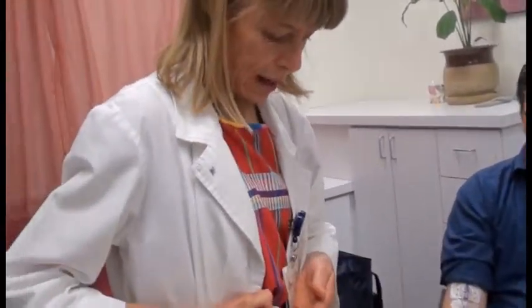All right, so when drawing multiple labs, there's another device. It's called the BD Needleless Luer Lock Access Device for multiple lab draws. So when we're drawing labs using, say, for TPN or a drug lab level where we need to draw multiple tubes, sometimes it's quicker and in the best interest of the nurse to use this device to get your lab samples.